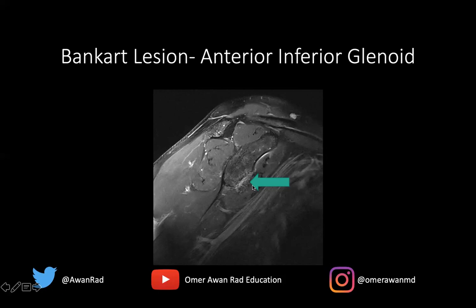Looking at the anterior inferior quadrant of the glenoid, there is a lot of edema and fluid there. Normally the glenoid should be a nice circle — this area should be convex, bulging outward. But now it's concave, bulging inward. Because we've lost the convex contour of the anterior inferior glenoid, we know there is a Bankart lesion. And since we've lost the convexity of the bone itself, this is an osseous Bankart lesion — the bone has been broken or contused along the anterior inferior glenoid.